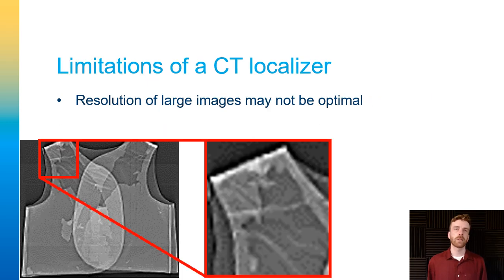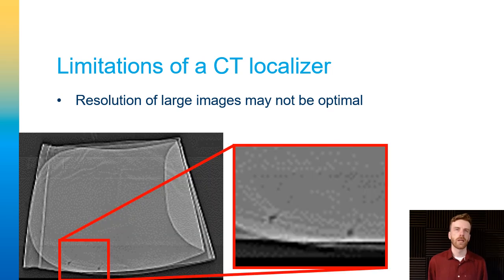Probably the biggest limitation of the Siemens brand scanner used here was the resolution on larger scan lengths. There's still enough detail to see significant damage, but you might want to see more detail once you find it. Here's an example of some minor damage that you can see on the same large scan length image. Again, you can see it, but not in much detail.